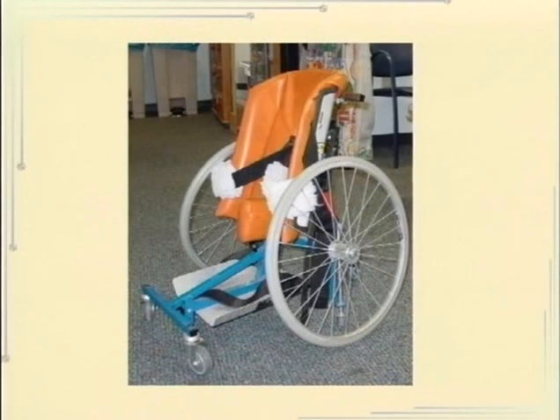This is a variation on that, which is a wheeled prone stander. So if an individual wants to be standing and doing some things standing, but also wants to be able to move around, you could think about trying out one of these mobile standing devices.